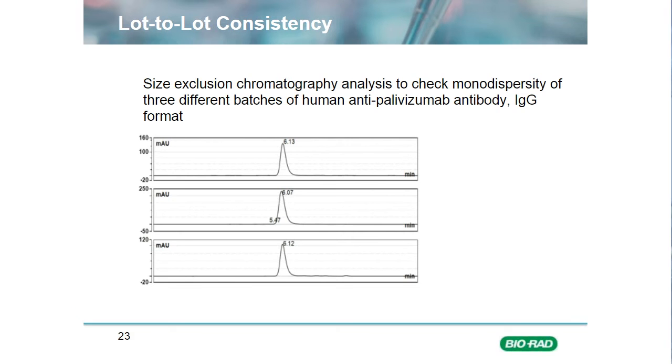Now, if you have QC or production requirements that are different to the standard offering of the supplier, these are things you should be able to discuss with them and capture maybe in a supply agreement. And this can also be an opportunity to put in place change control notification on critical reagents to make sure that you are notified of any changes or planned changes in process that might potentially affect your product.